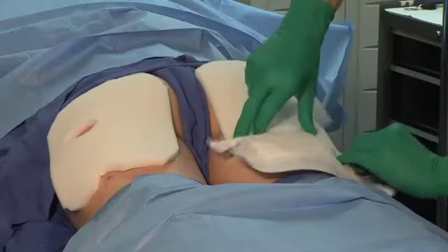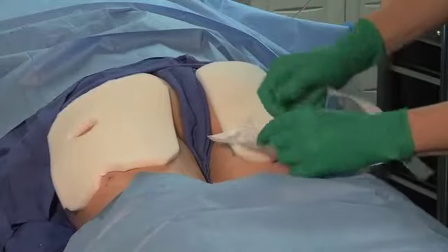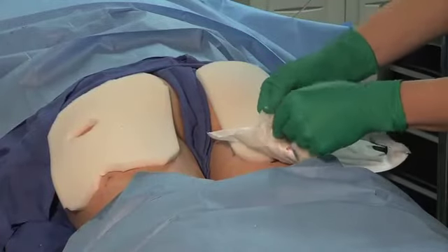Post-operatively, you're going to get a little bit of drainage because this kind of laser wavelength that we use is not coagulating. In other words, it doesn't stop the bleeding like a lot of lasers do. But that's part of why I think it works and works so well. In a day or two, you're usually back to most of your everyday activities. You do wear a compression garment over the area for about a 3-week period of time, because we're trying to keep down the early swelling and bruising. You're going to see results very early in the process. The first week is when you've got most of your swelling and bruising, and you'll see the results even after the first week. But when the garment comes off in 3 weeks, the patients really claim to see significant advantage. And then as the months go by, when the skin thickens up, it gets better and better.